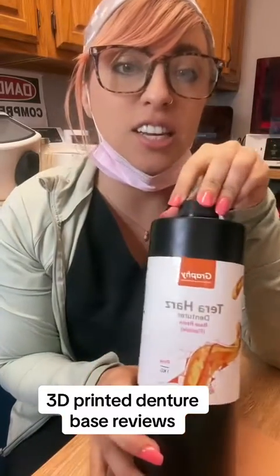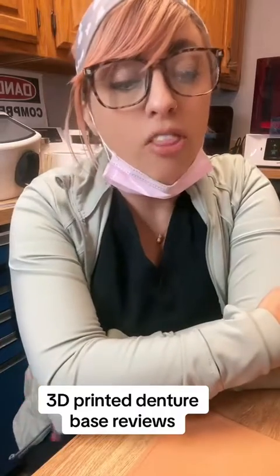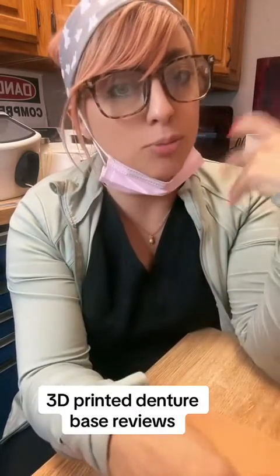The last one we have is the Graphy Terra — it's a flexible base that just came out. It's flexible like a nightguard, not flexible like a Valplast. When you're delivering it, run it under hot water — it gets a little more flexible under warm water, similar to how nightguard flex works. It is slightly translucent. I'm a big fan of it. You cannot glaze it because it's flexible — the glaze will just come off — so you need to give it a really good polish.